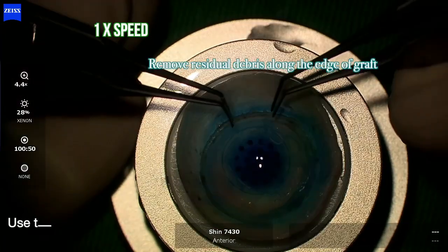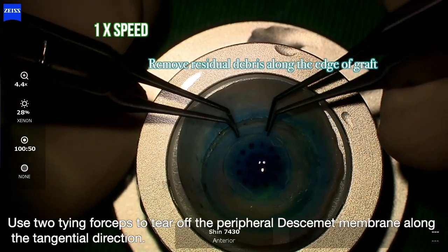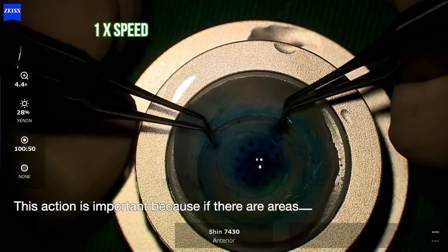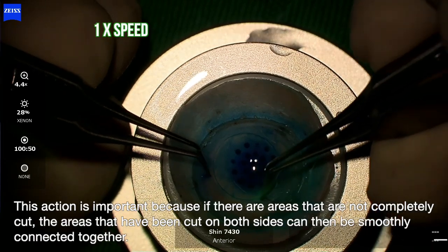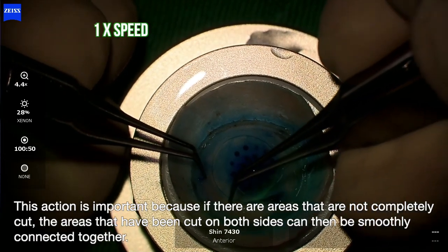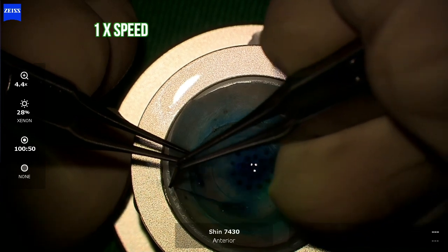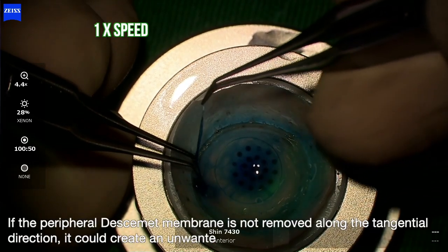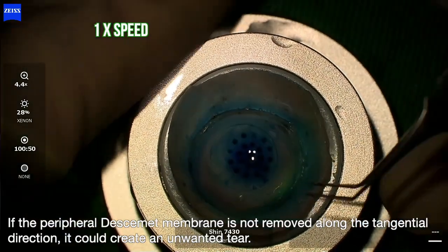At this point, the trypan blue can be used to check if any tissue has adhered to the blade. Use two tying forceps to tear off the peripheral Descemet membrane along the tangential direction. This action is important because if there are areas that are not completely cut, the areas that have been cut on both sides can then be smoothly connected together. If the peripheral Descemet membrane is not removed along the tangential direction, it could create an unwanted tear.